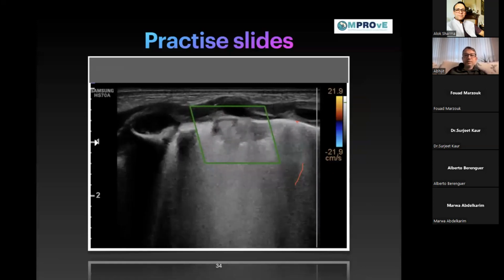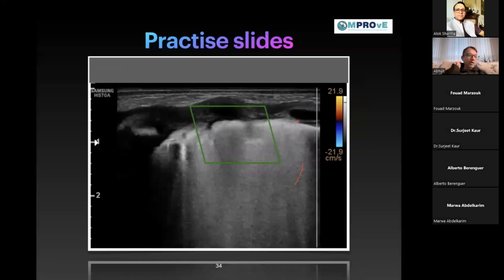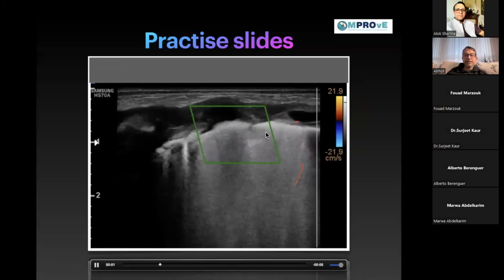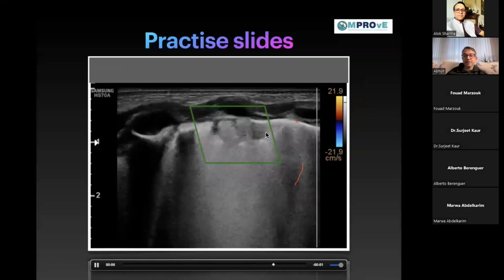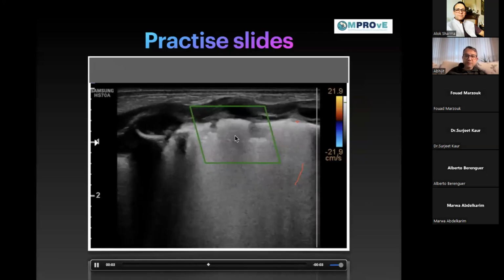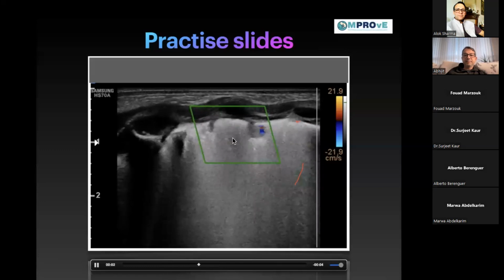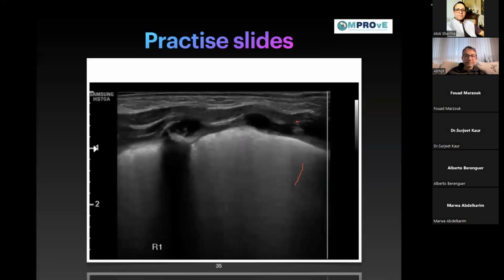This is what we do. Doppler. And when you do the Doppler, you're trying to look for the vessels. You can see the vessels coming into the picture there, feeding into the area. And well, this is not plain simple collapse, it's consolidation. And if you look macroscopically here, you will definitely see the areas where it's popping off as bright speckles, the dynamic bronchograms. Next one.